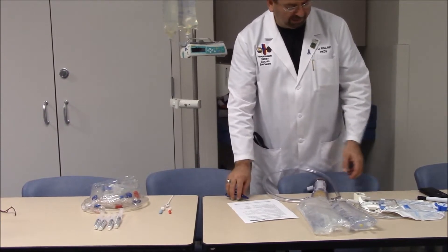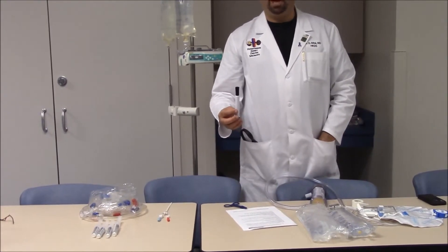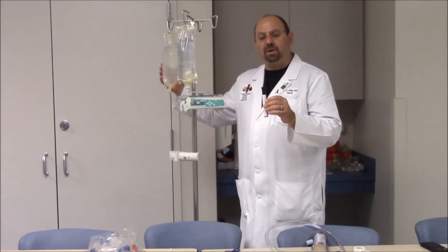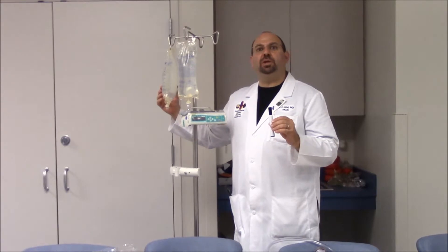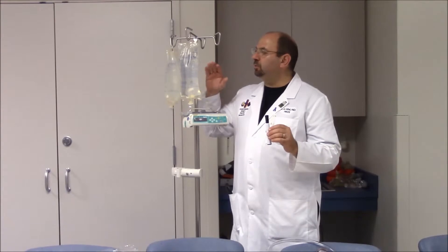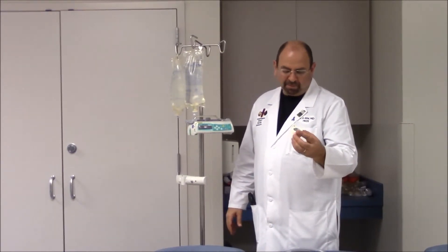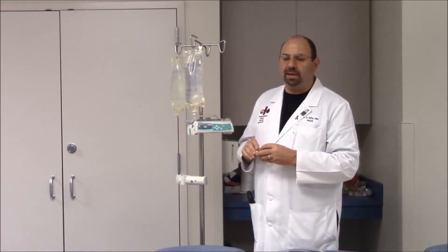We also need a black marker. The purpose is to label the bags — for example, writing 'bag number two, 1,000 units of heparin' when we mix heparin into the second priming bag, and labeling the full heparin infusion bag of 10,000 units per liter running at 100 cc. We also need silk tape to put on the bags and write notes for ourselves.